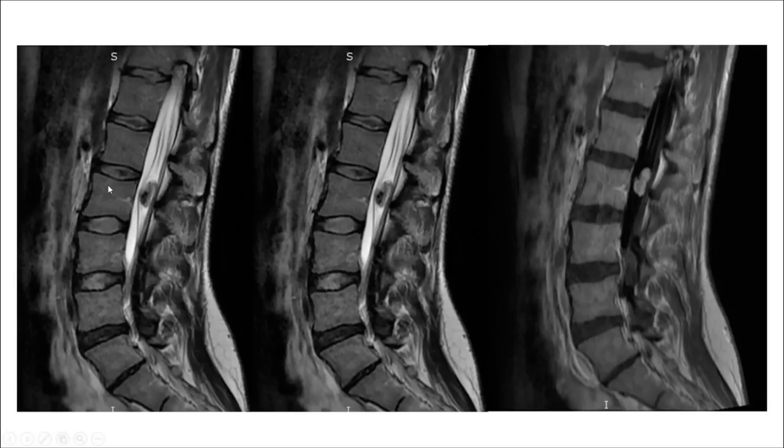This is actually the same as this one. These are the same for whatever reason. But here's the T1 that shows some enhancement of this tumor. Very well circumscribed. As you see, it's not really in the substance of the cord. It's really associated with probably nerve roots or the filum terminale, which is a code word for this.